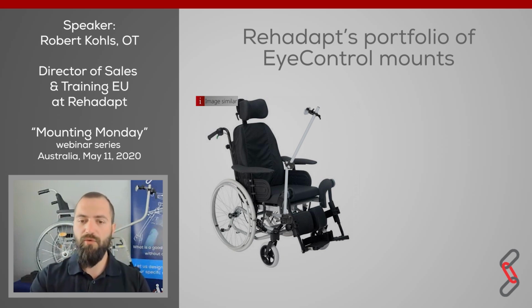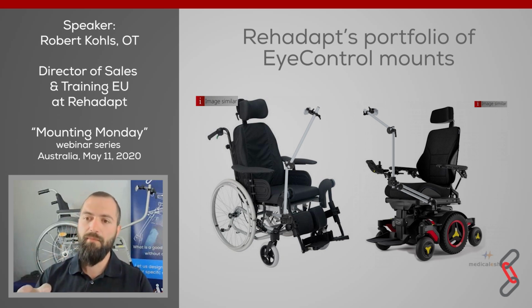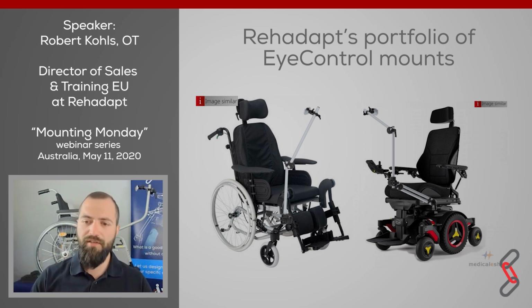But for example, on that chair, we can have a very good and stable attaching point under the seat. Under the seating plate, there is a covered tube where we can attach a frame clamp and go with a single tube, very easily forward, and with the other tubes in the right direction. If the wheelchair has, for example, like in that example of that Permobil wheelchair, an easy to attach frame construction with a unitrack rail system on the side or under the armrest, we could also install a double tube HD arm on the side very easily.